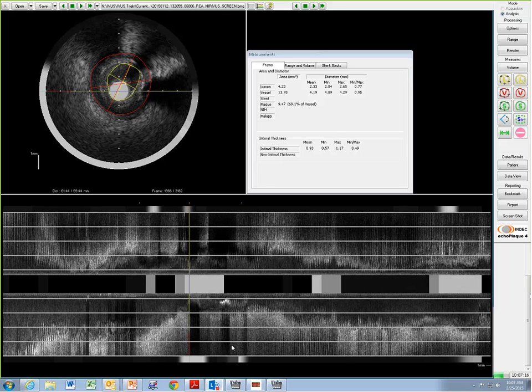I think it's important to discuss, especially because 3.5 is the largest BVS we have today. If I had a 4.0, then I could have done it, but I just have the 3.5, so that's why I don't do it.